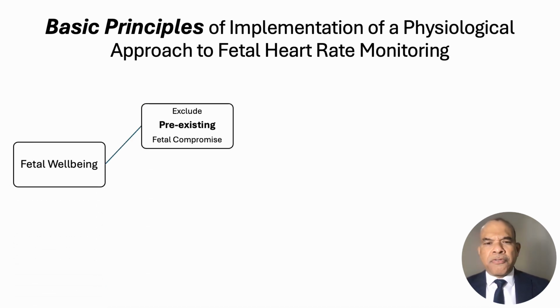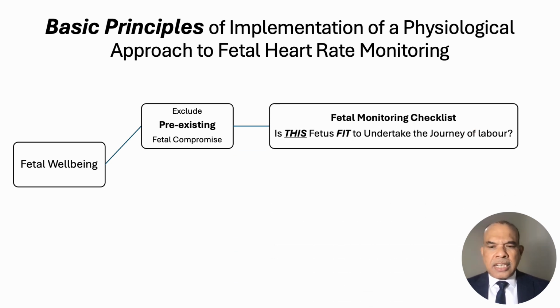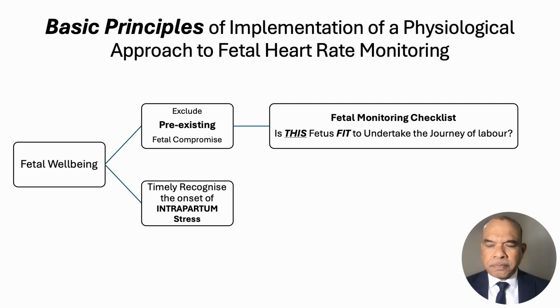If you are talking about fetal well-being in labor, we need to exclude pre-existing causes of fetal compromise. In the 2018 guideline, we introduced the concept of, is this fetus fit to undertake the journey of labor, by having a fetal monitoring checklist at the beginning.